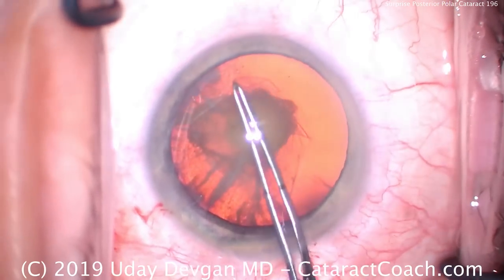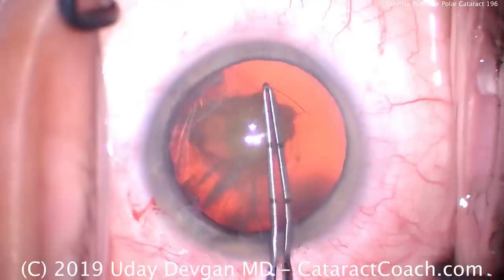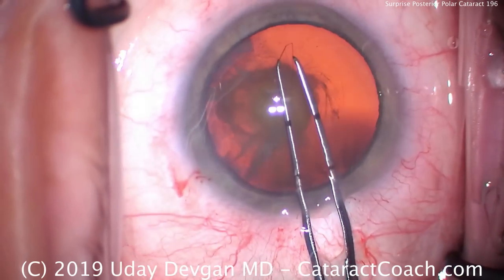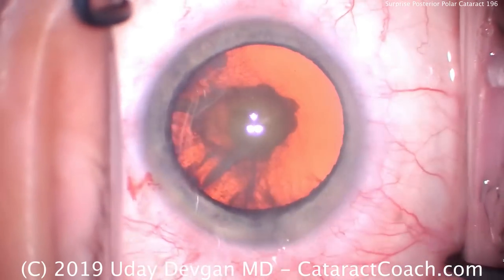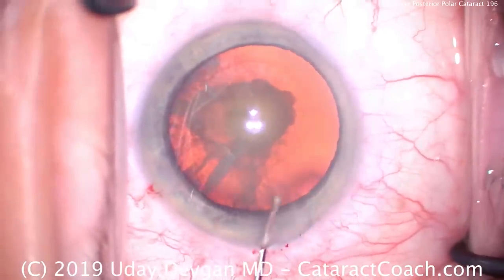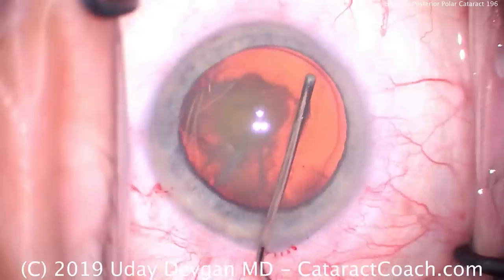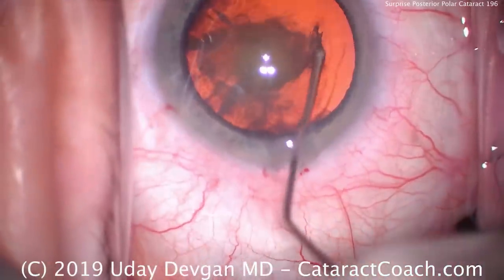So we have to do things differently. We're making a nice, very consistent capsulorrhexis here, because there's a higher chance they're going to have to put in a sulcus lens or some other form of lens fixation such as optic capture. If the capsule breaks, we cannot put the lens in the capsule bag. Now, avoiding hydrodissection — we don't want any hydrodissection, just hydrodelineation.